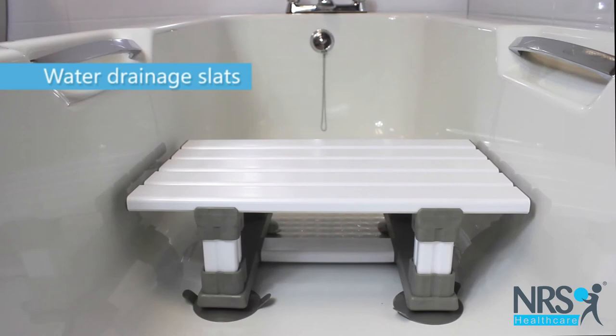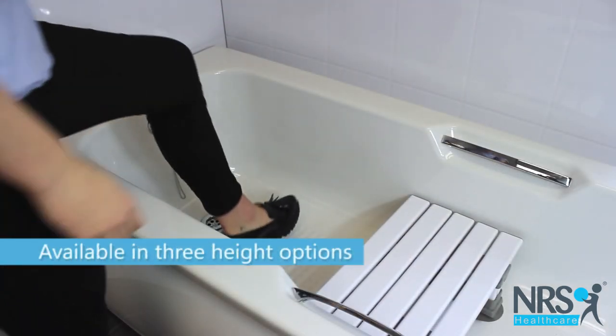The seat is comfortable and features slats to drain the water. It comes in three height options.